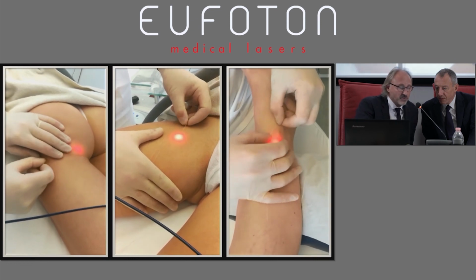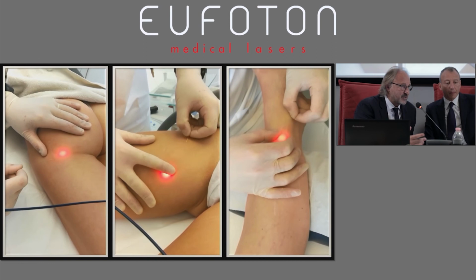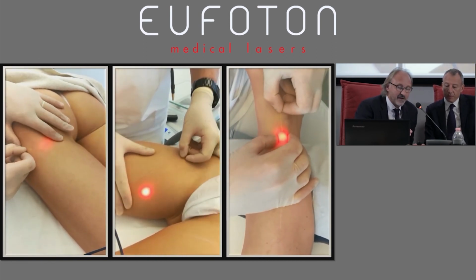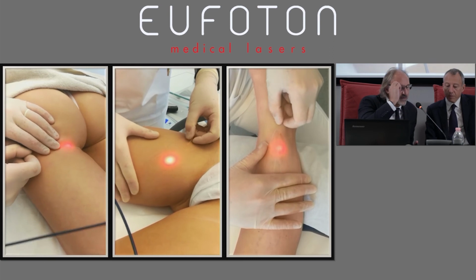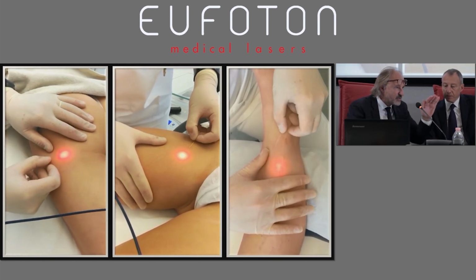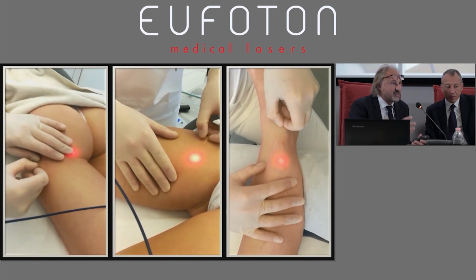And I go back with the combination with surgery. That's an area with traditional liposuction in a way. And so we do the remodeling with lipolysis, with the gentle remodeling. That's a good asset. That's a good combination. Liposuction, and I go underneath with the laser. Also in the trochanter region.